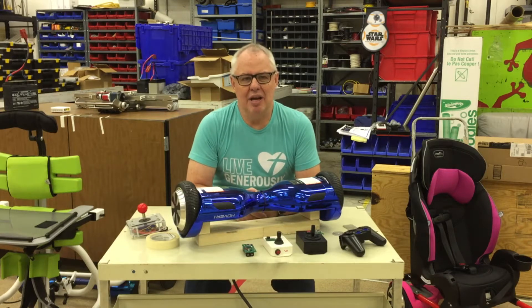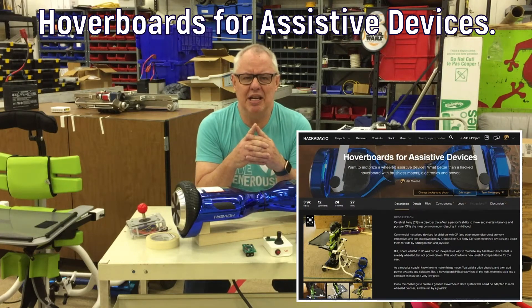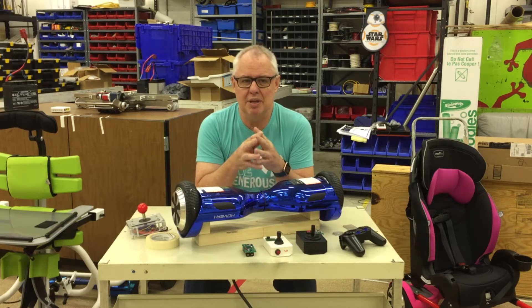Hi, I'm Phil Malone and I'm here to introduce my project Hoverboards for Assistive Devices. My project is not about creating a standalone product or program. It's all about providing a new capability or tool that anyone can use to build a specific solution for a specific individual. My mission is to help people achieve freedom of mobility by providing an affordable means to motorise low-cost wheeled devices.